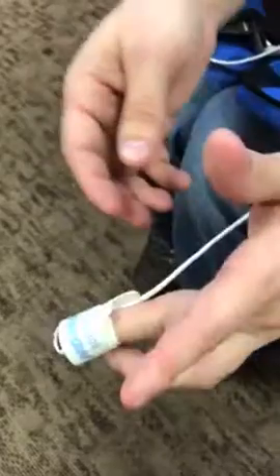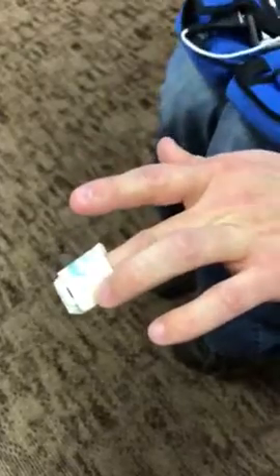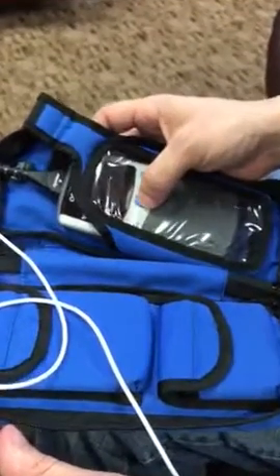This will wrap under the finger like this, and then this wraps around just to secure it. Don't get it too tight, otherwise it'll cut off circulation. The cord should be running down into the palm.